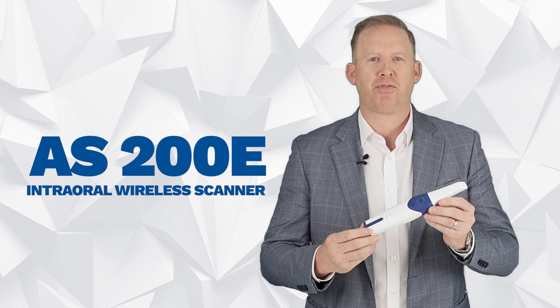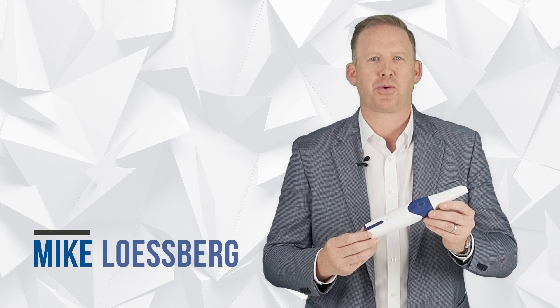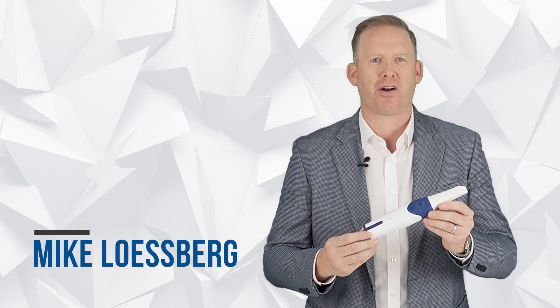The intraoral scanner you've been waiting for, with the benefits that nobody else has to offer. I'm Mike Lesberg with NewSmile, and I can't wait to tell you about our newest product — the AS200E intraoral wireless scanner.